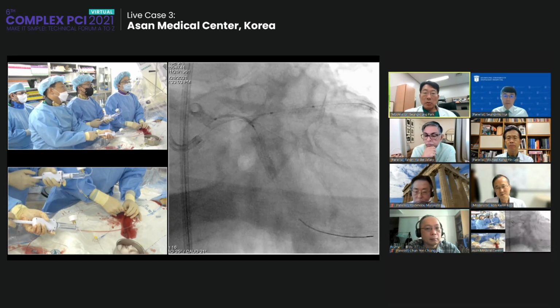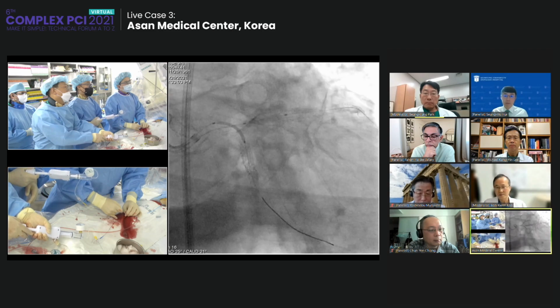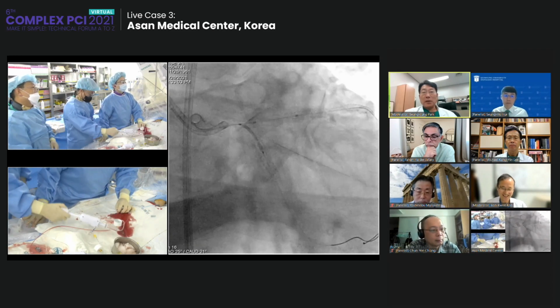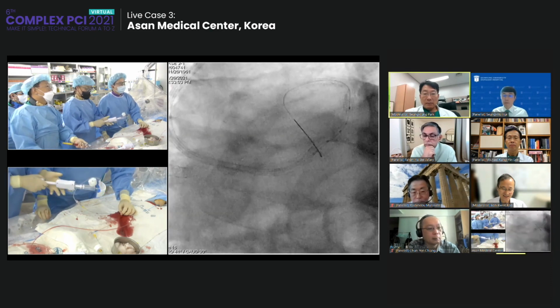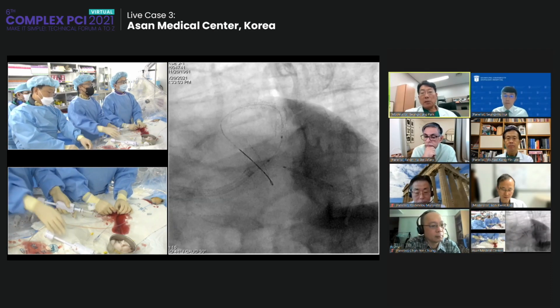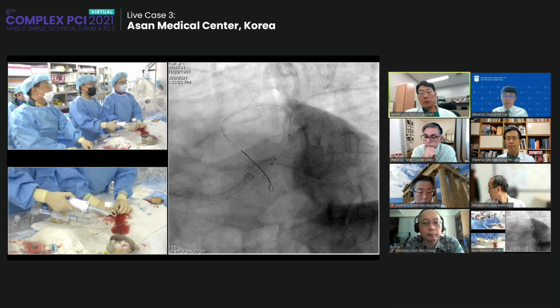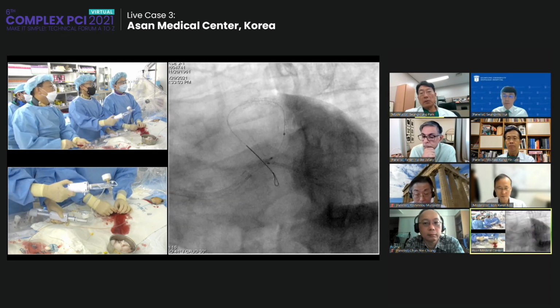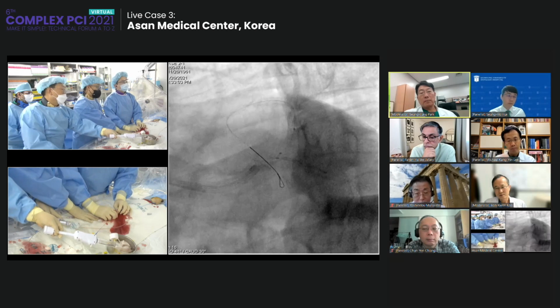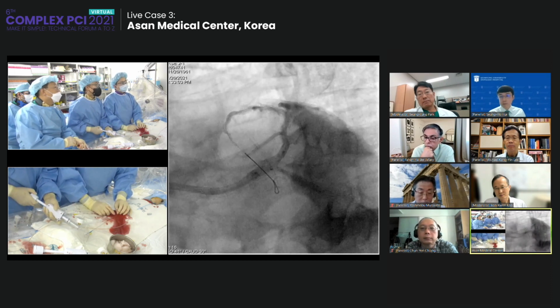You didn't do pre-dilation, right? Just direct stenting. Okay. Yes, go. Then we're going to move to the spider view. Stenting. Great. I think it's a little bit further in. You want to make a mini crush, right? In terms of that, we don't like too much crush. Okay, here. So I think this is okay.